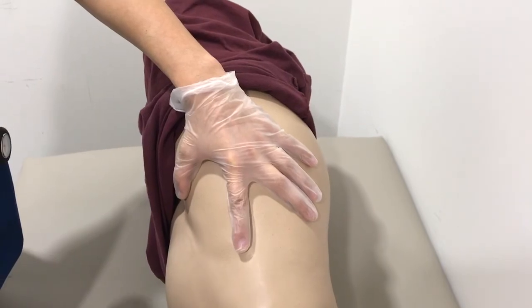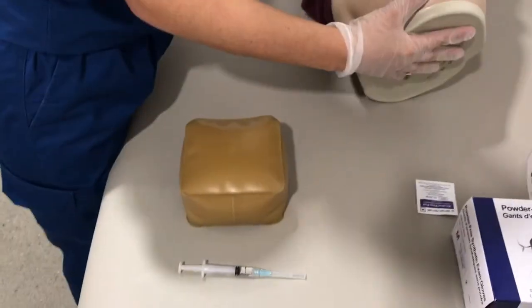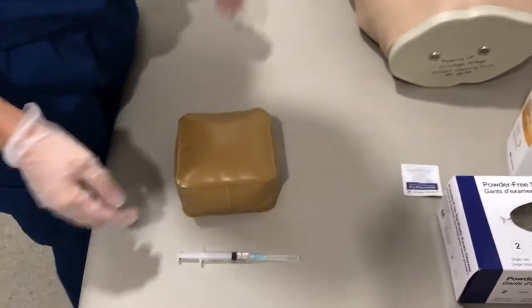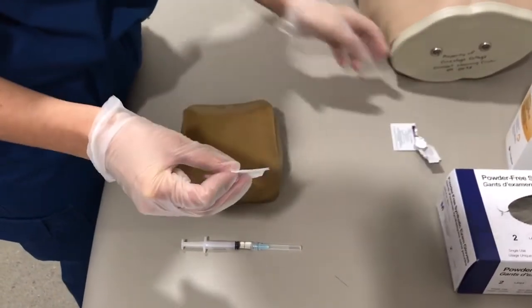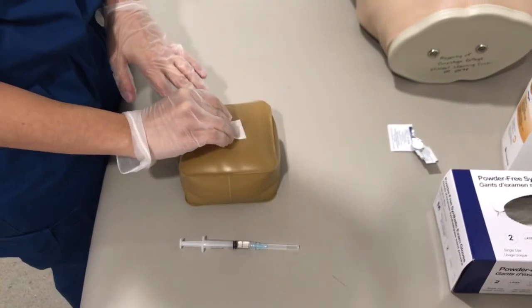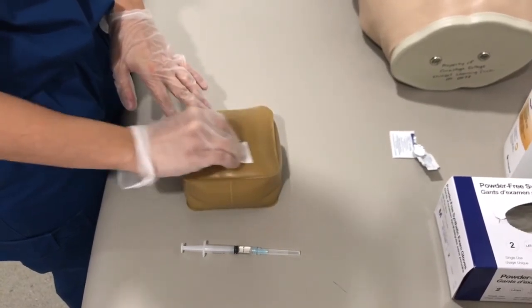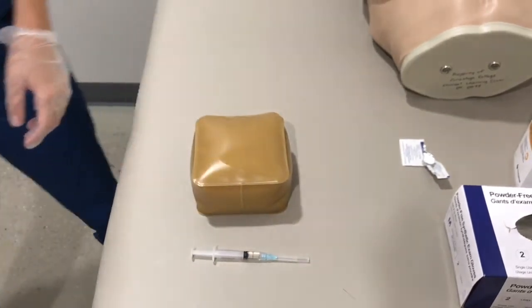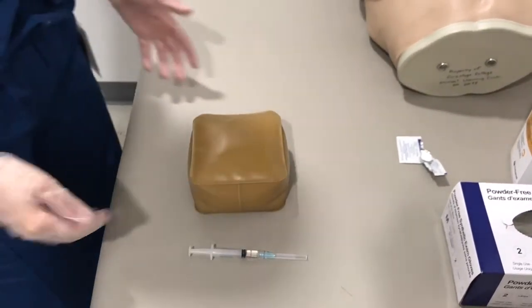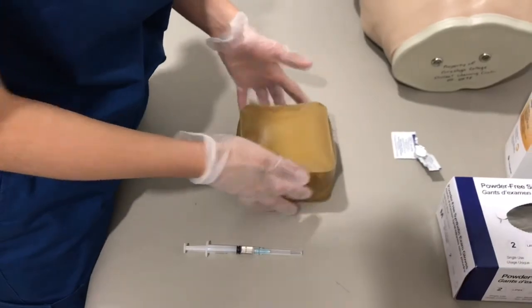And again, for educational purposes, we're going to be using our injection pad. So what I'm going to do again is take out my alcohol wipe and start in the center of the place where I'd like to inject and do a circular motion outwards. And discard of that. Wait for the alcohol to dry, which could take a minute.